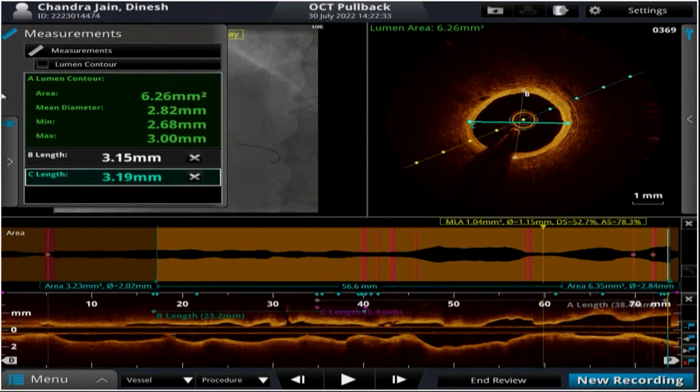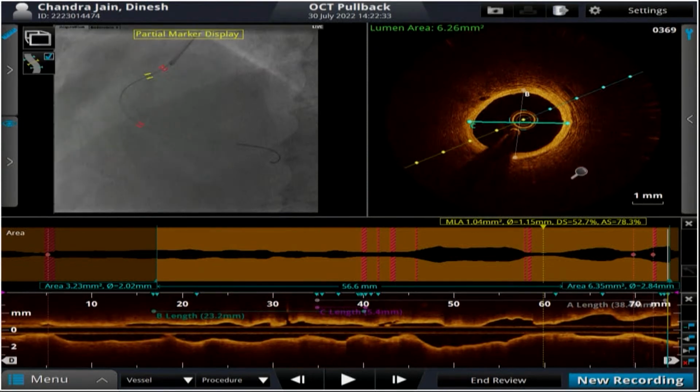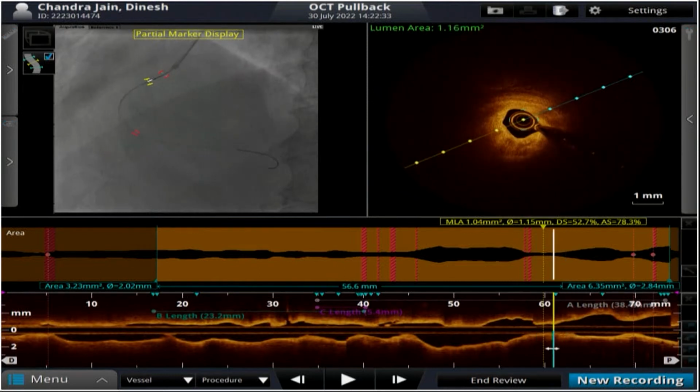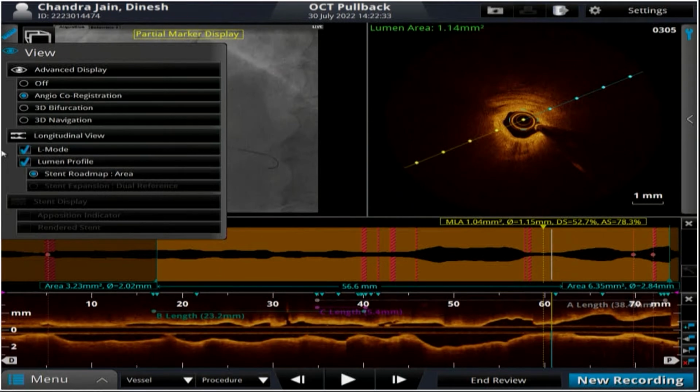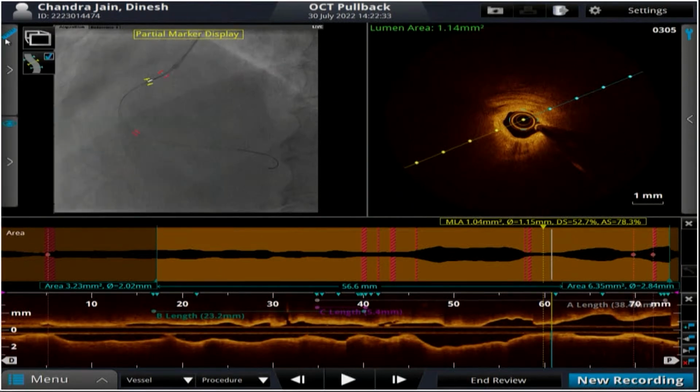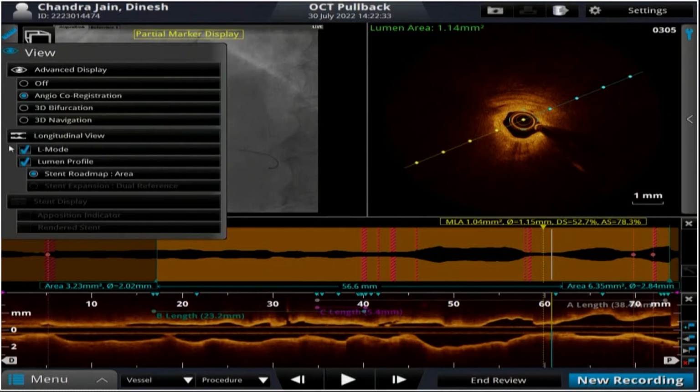The next thing to see is the nature of the lesion. Can we just see the morphology in the 2 places that we've identified? Ajay, I think you've shown us very good images over here with the saline and excellent co-registration, right. So we are happy with that injection of yours. You can give us the length and the diameter that you're thinking of.